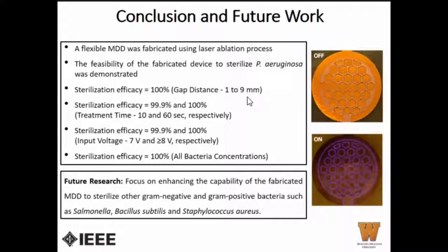And future work is focusing on enhancing the capability of the fabricated devices, performing variation of the curvature and bending, and focusing on other gram-negative and gram-positive bacteria like Salmonella, Bacillus subtilis, as well as Staphylococcus aureus, to expand and show the efficacy of this system.